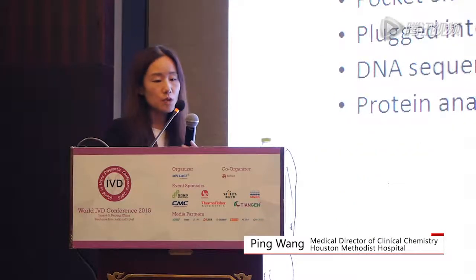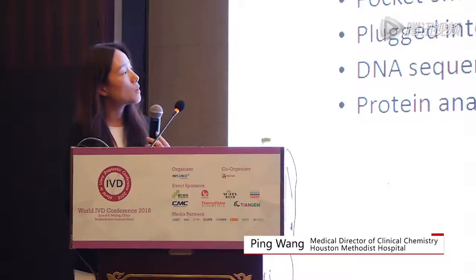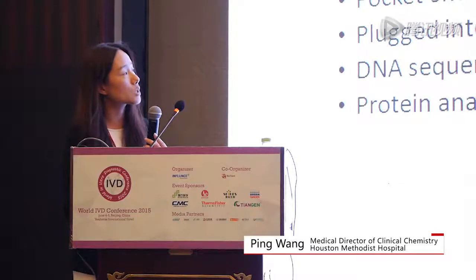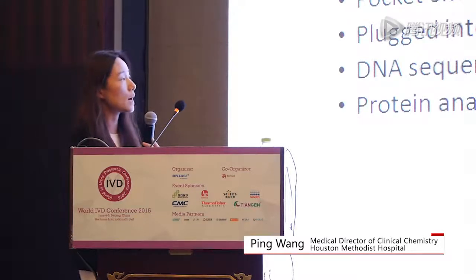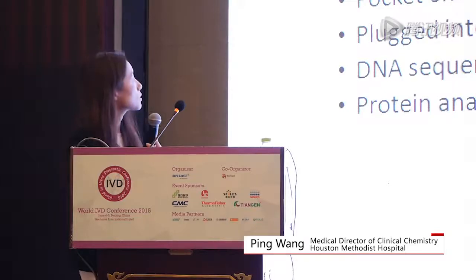And then increased application of genomics. Here I give you an example which looks really like a mini USB drive and has USB connection to a laptop. However, it's actually a single molecule sensor analyzer. On the surface of this, they have built microfluidic channels, and you can directly apply patient sample, either blood or saliva or urine, onto the surface here, and then it can achieve single molecule analysis, including single molecule DNA sequencing or other proteomic applications. So very cool technology as well, and I believe very promising in the next generation point of care.